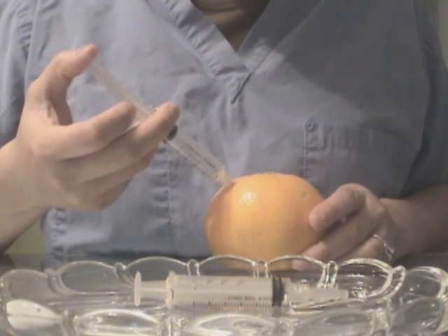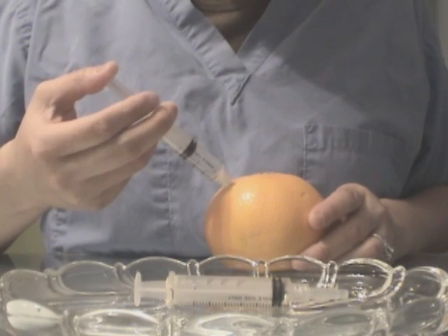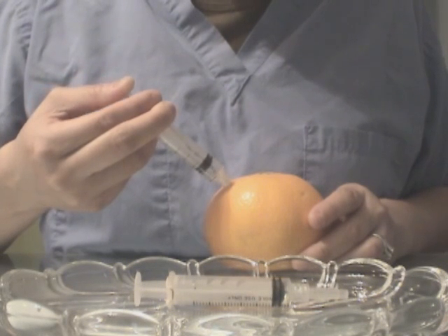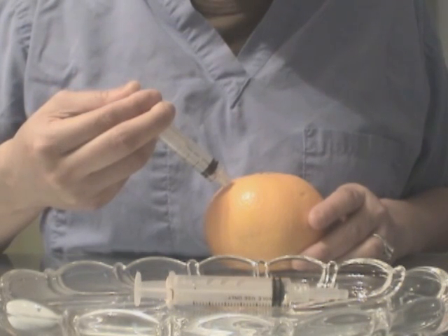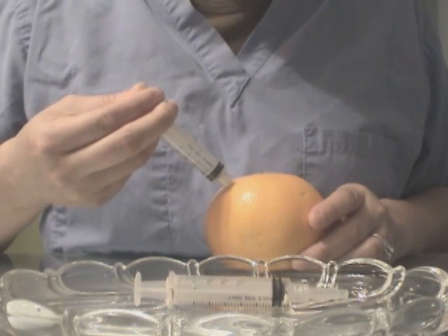You want to slowly inject into the area — very, very slowly. You want to make sure you give it a push right at the end to make sure all the liquid is injected.